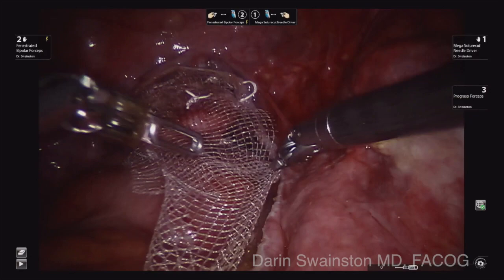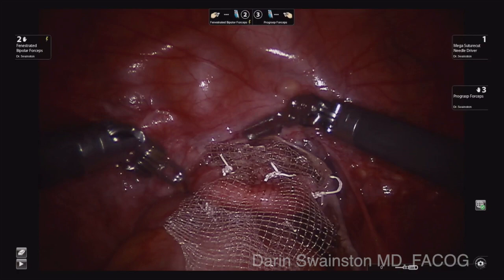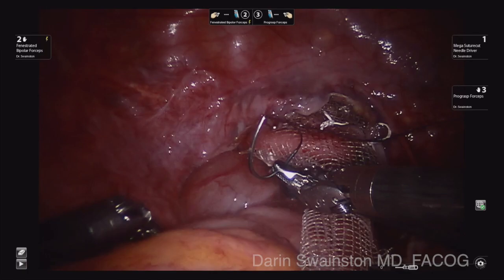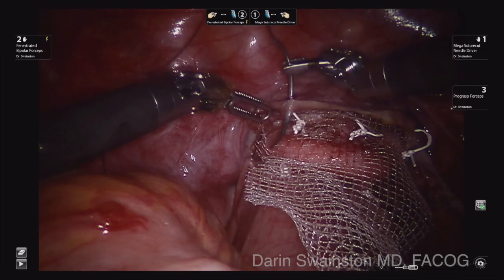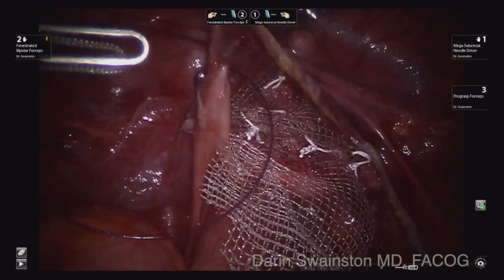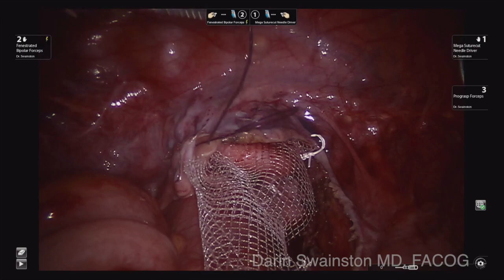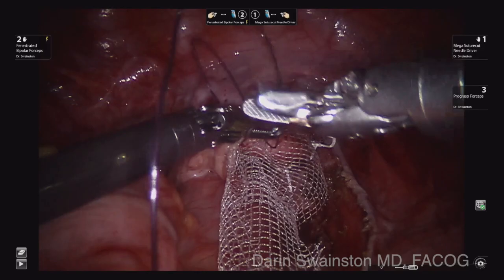I just used a V-lock to close this area with a 2-0 V-lock. I have used 3-0 but I think 2-0 is better — a little stronger suture. I start in that left corner and work to close the whole area. I use the third arm to hold the bowel out of the way so I can reach back and get that posterior peritoneum — that is the hard part to get. If you do a hysterectomy you have two areas of peritoneum on this right side, but since this patient already had a hysterectomy, we have this nice line to follow. Just be careful that you do not capture the ureter on the right side with this peritoneal closure.